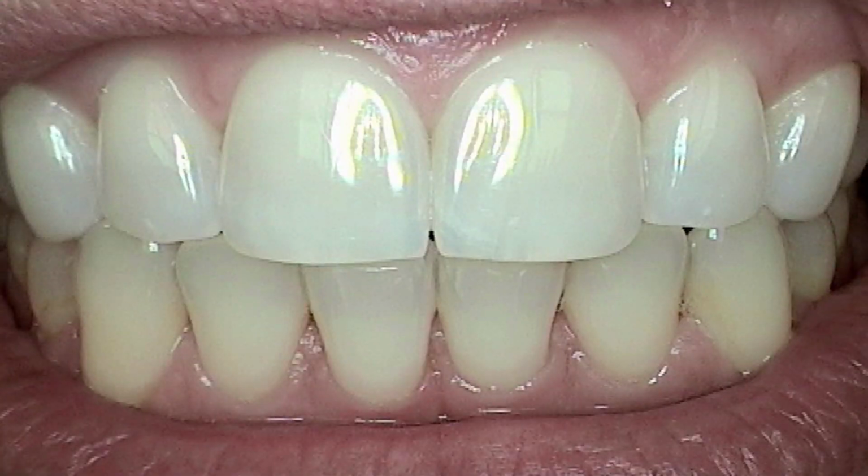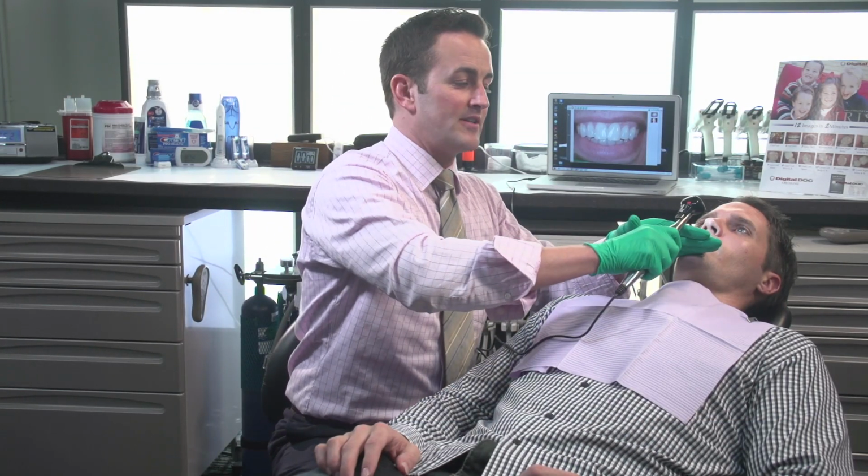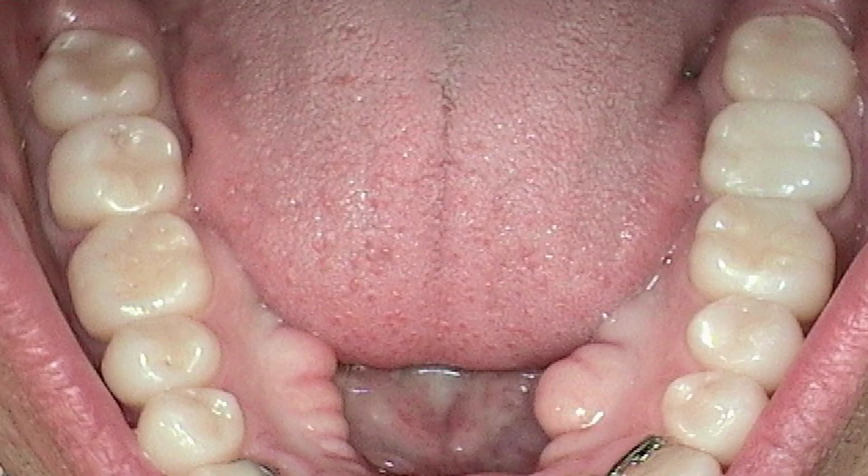Okay, perfect. For the lower arch, simply keep the position on the labiomental groove, and we're going to tilt the camera out 45 degrees. Don't forget to have the patient open their mouth. Perfect.